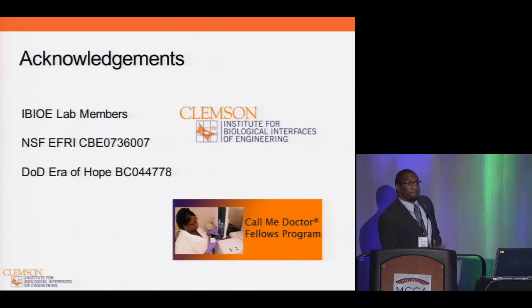Could I just follow up on the question about the size of the yarns? Absolutely. So what was the distance between the yarns? Or can you give us some idea? Because you didn't give us any images of the fabrics. Right. In another study, we're looking at the pore size and the porosity, and the pore sizes are around the 100 to 150 micron range between the fibers for the 50-50 mesh configuration.